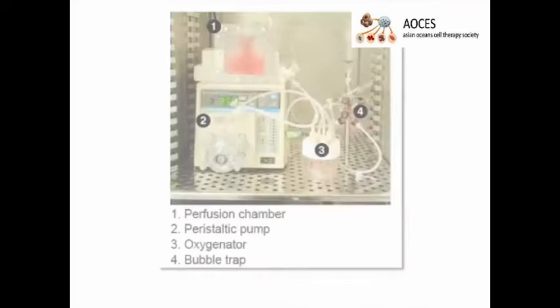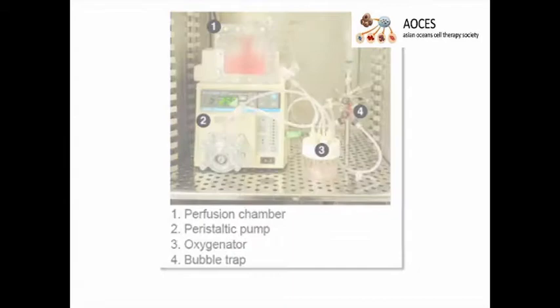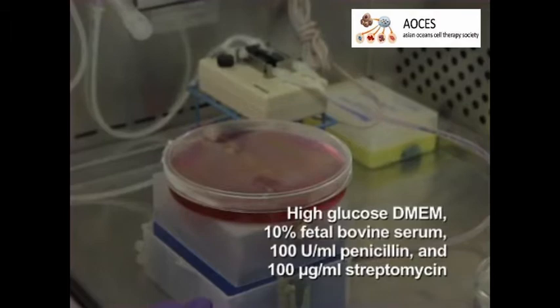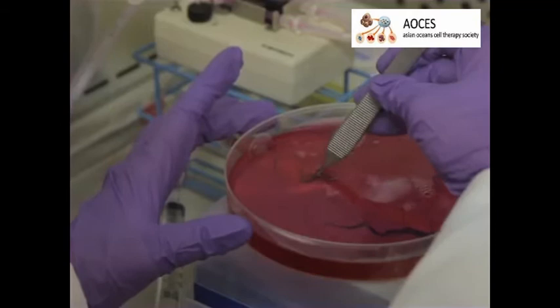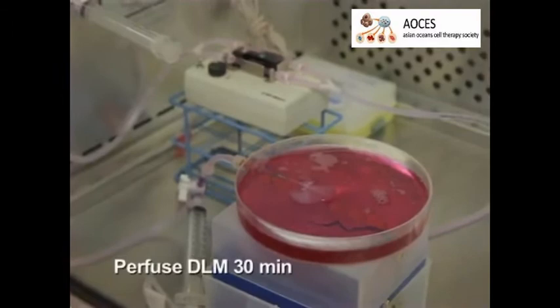To recellularize a decellularized liver matrix, under a tissue culture hood, begin with a perfusion system similar to the one used to decellularize the liver. Fill the perfusion system with 200 milliliters of culture medium such as high-glucose DMEM, 10% fetal bovine serum, 100 units per milliliter penicillin, and 100 micrograms per milliliter streptomycin. Place the DLM into the perfusion chamber and connect it to the perfusion system through the portal vein cannula while the pump is running at 5 milliliters per minute to avoid formation of any air bubbles. Allow the medium to perfuse the DLM for 30 minutes.